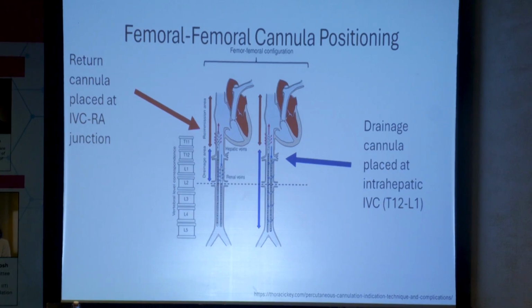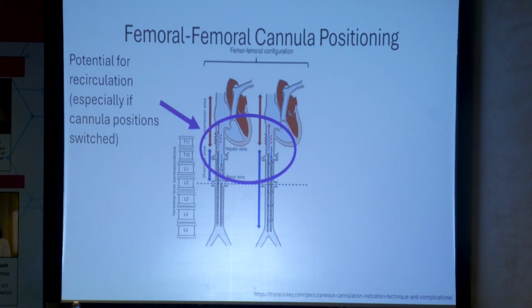I'm not a cannulator, so I don't have all the answers to cannulation questions, but Raghu and Steve probably have more to say about that in the sessions as well. Certainly there is potential for recirculation depending on where those two cannulas are relative to each other.